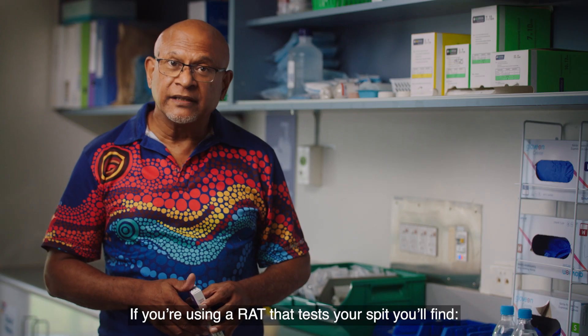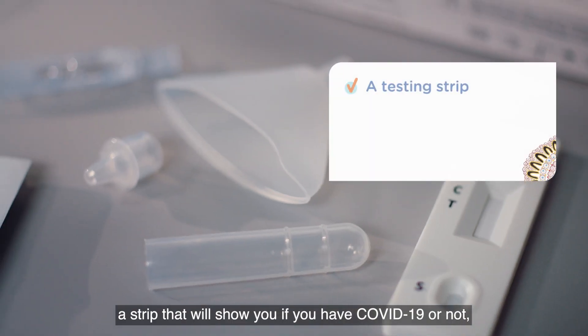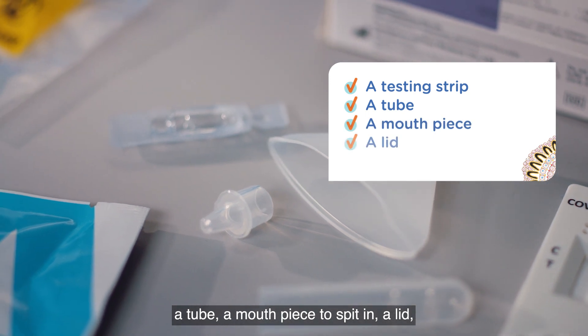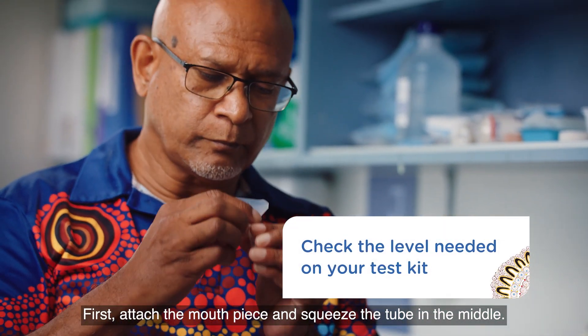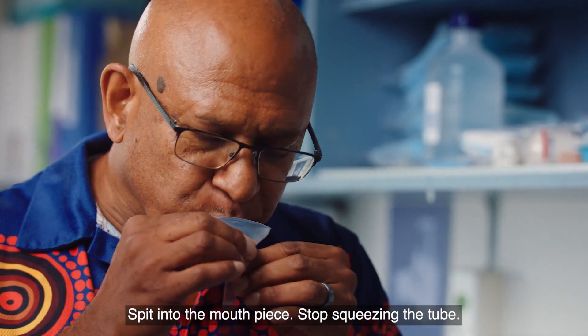If you're using a RAT that tests your spit, you'll find a strip that will show if you have COVID-19 or not, a tube, a mouthpiece to spit in, a lid, and a small pack with liquid called the buffer. First, attach the mouthpiece and squeeze the tube in the middle. Spit into the mouthpiece. Stop squeezing the tube.